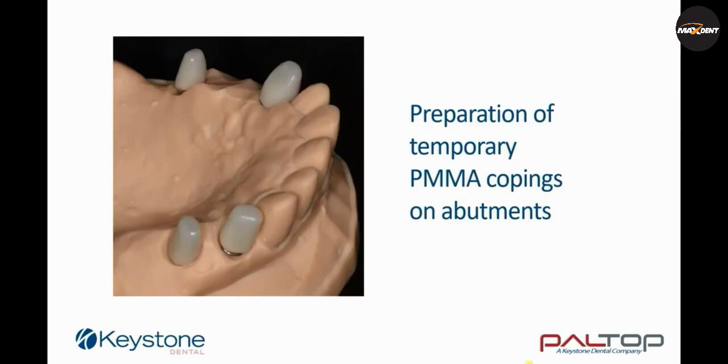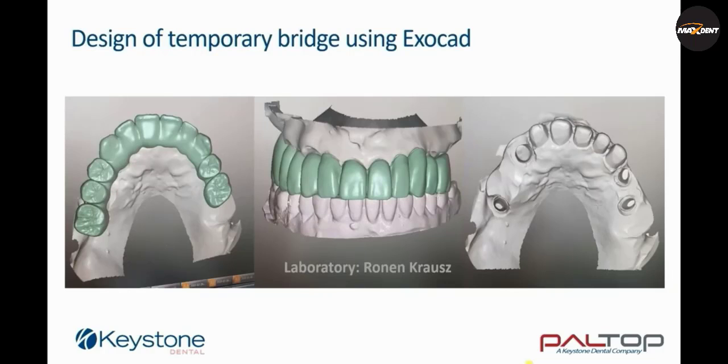The copings not only cover the screw access channel, but also have an intimate friction fit with the abutment finish line. The model is scanned for a second time, and a one-piece temporary cement retained bridge is designed. The distal segments of this bridge will seat on the abutment copings. The anterior segment will seat on the prepared teeth. Following osseointegration of the implants, a final bridge will be delivered in 3 segments.